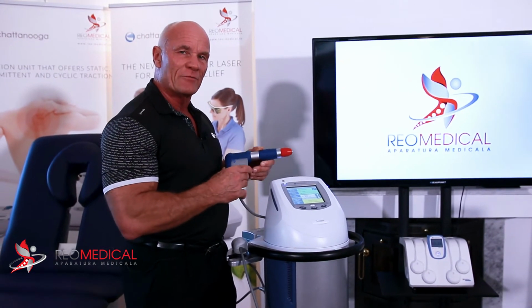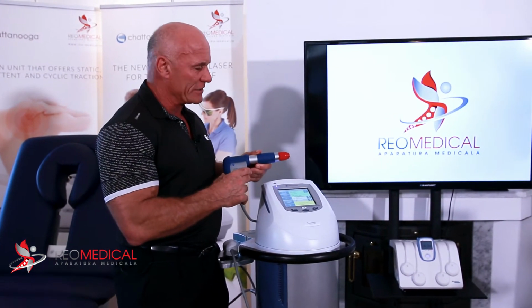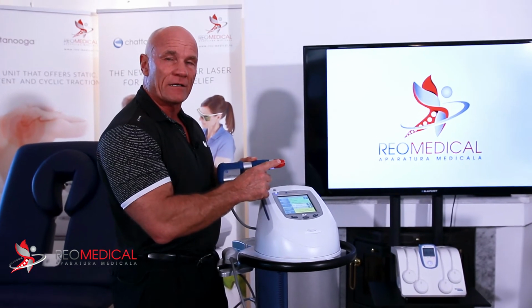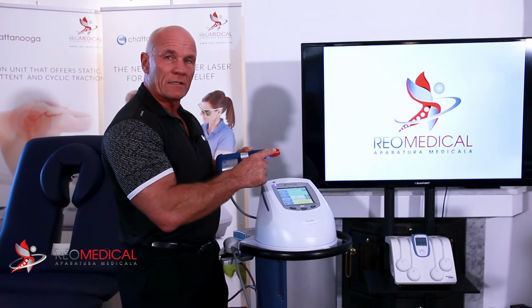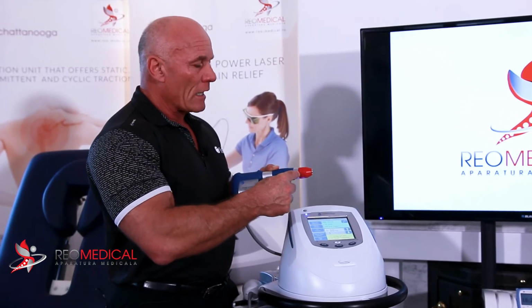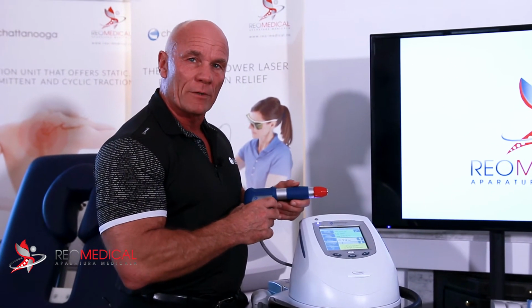And if I give you any advice today, guys, I would always ask, when you're considering looking at radial pressure wave, to ask what is the EFD of the manufacturer's transmitter. Because the bigger the EFD, the more energy we can put into the tissue. It's been shown that the more energy we put into the tissue, the quicker we can resolve a patient's problem.